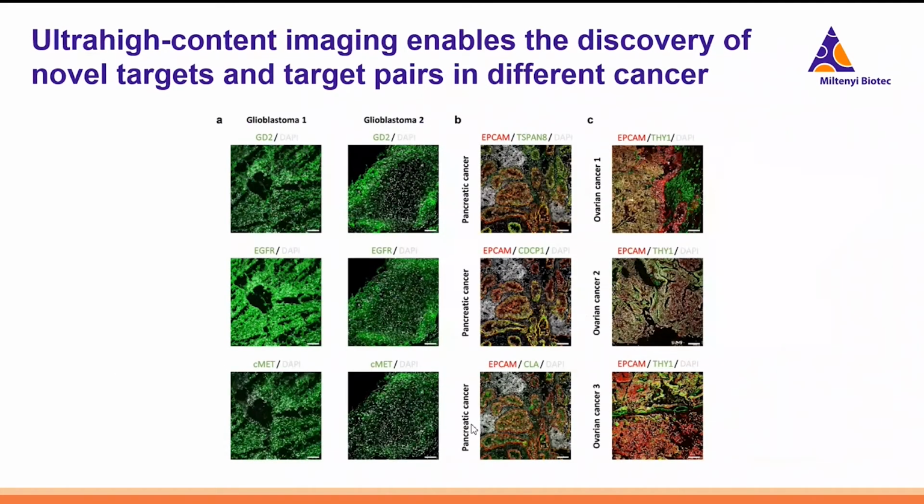Now, in the next step, they wanted to identify markers that are selectively expressed on solid tumor cells, but not in healthy tissue, to develop cell-based immunotherapy. In general, the identification of suitable targets for CAR T cell therapy of solid tumors has been difficult, as most targets either do not cover a large enough percentage of tumor cells within a tumor and across different patients, or are not exclusively expressed on tumor material, but also present on healthy cells.